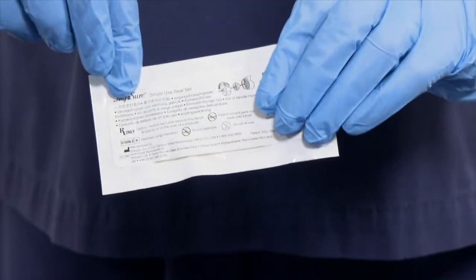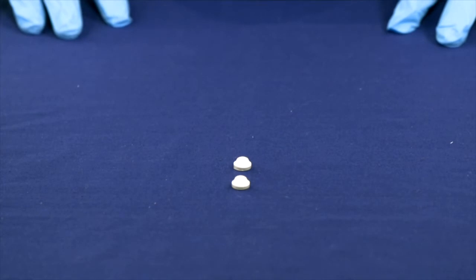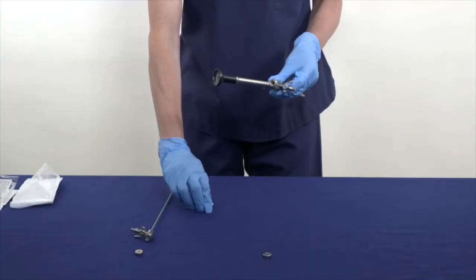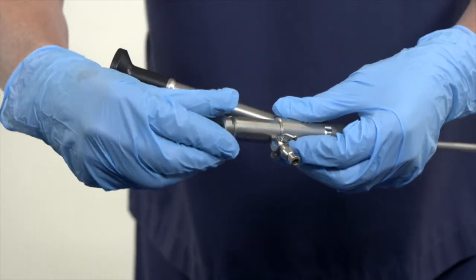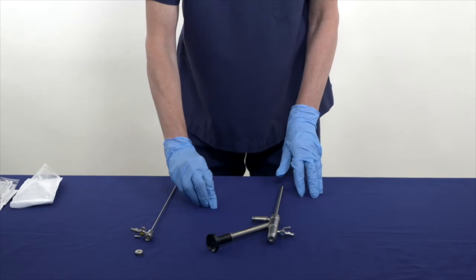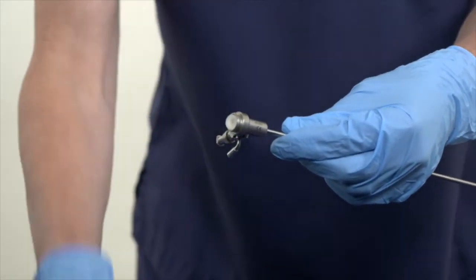Open the single-use scope seal packet carefully on the side which says MyoSure, and this will reveal two dome-shaped seals. Take one seal and insert it into the end of the scope, ensuring the dome shape is facing down, and screw on the end cap. Insert the second seal into the end of the outflow channel, again ensuring the dome shape is facing down, and screw on the end cap.